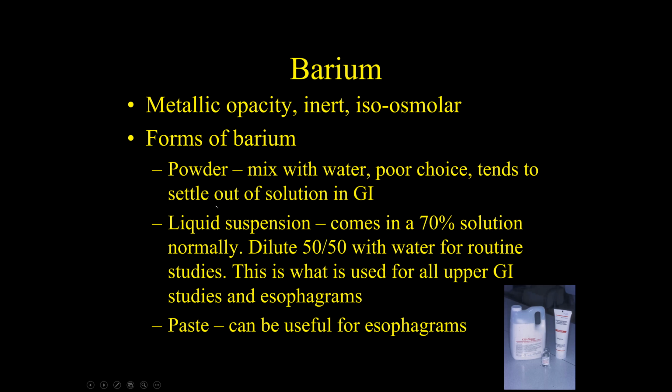There are other forms of barium that you can buy too. You can also buy barium that comes as a powder, in a little tub, kind of like you would buy cottage cheese or sour cream at the grocery store, with white powder in it. You can take that powder and mix it with water yourself, but it works out not well at all, because no matter how much you mix it up, how forcefully, even if you put it in a blender, that powder very quickly will settle out to the bottom, to the gravity-dependent portion. The result is you get a poor quality study.